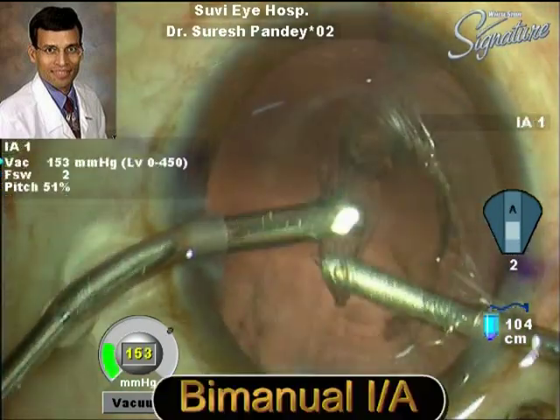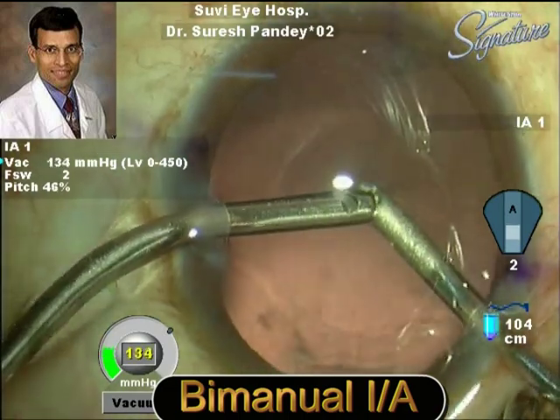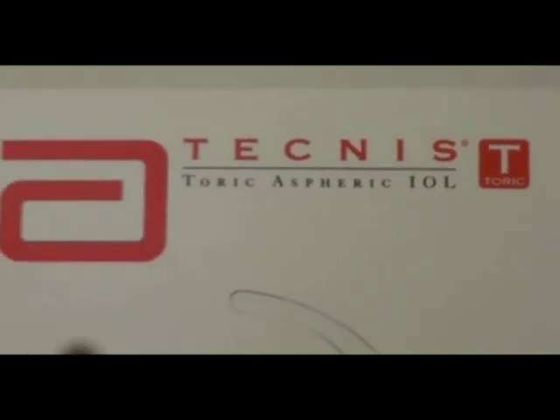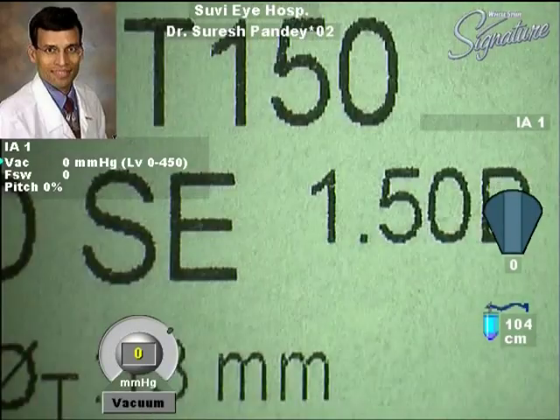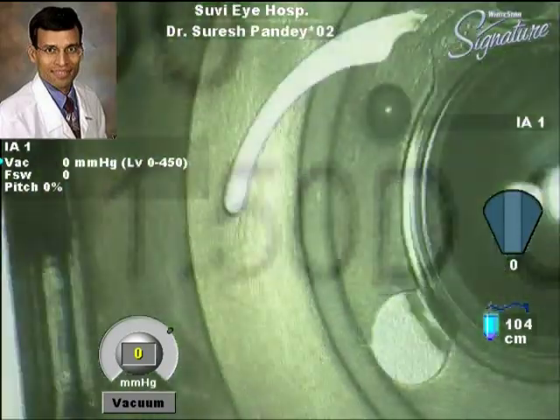Bimanual irrigation-aspiration is now being done to remove the cortical matter and to clean the capsular bag very well. This is the TechnosToric aspheric IOL that was implanted. In this particular patient the ZCT150 model was used.